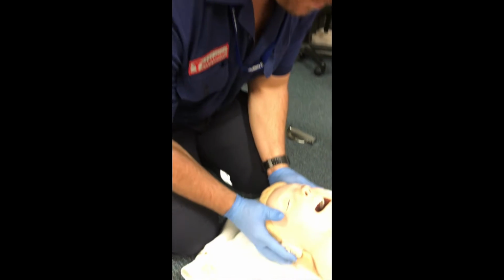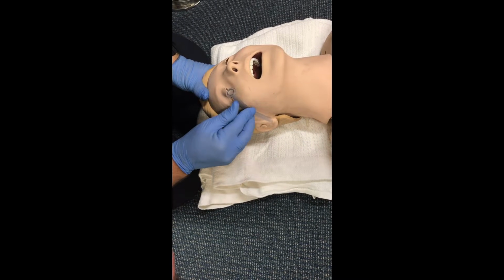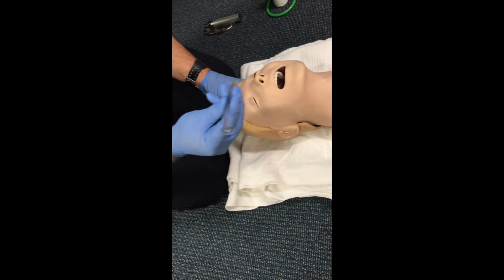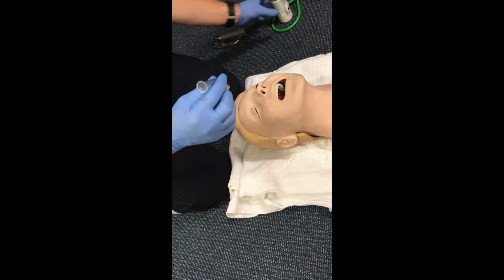For NPA insertion, select the appropriate airway by measuring from the corner of the nose to the earlobe. The diameter of the NPA should be slightly smaller than the nostril opening that you pick. Apply lube to the NPA. Inspect nostrils for any obstruction and select the widest nostril.